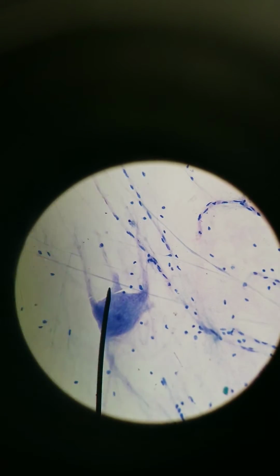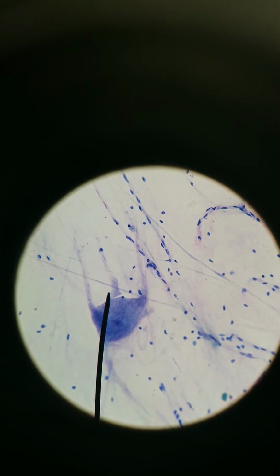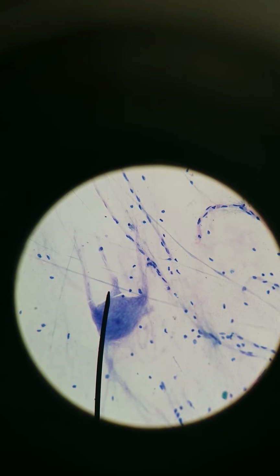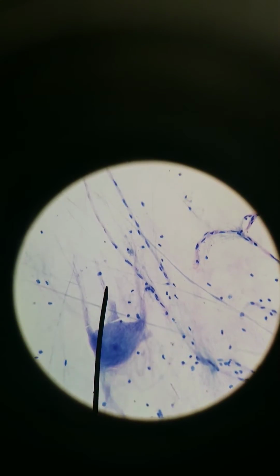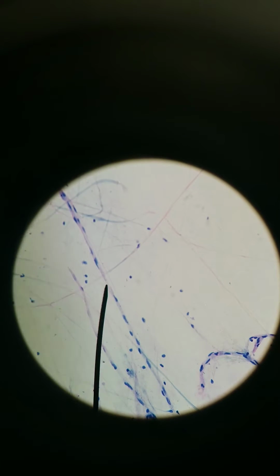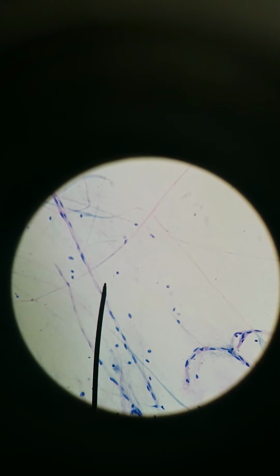Dendrites are the ones that detect signals from other neurons or from stimulus. Axons announce. They send signals to other neurons or to target tissues. These axons, you can see like here's an axon of a neuron, and you can see these nuclei that run along the axon.